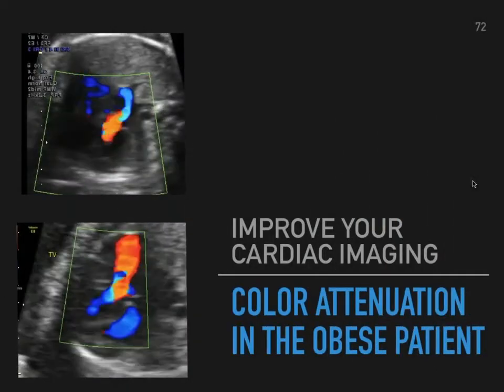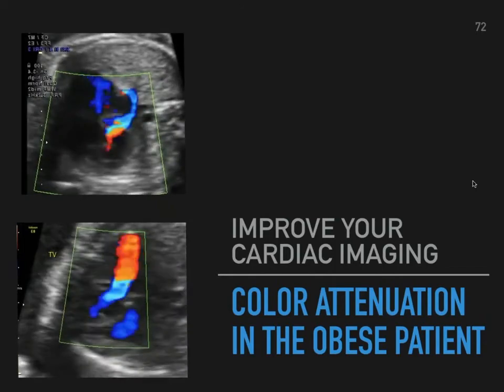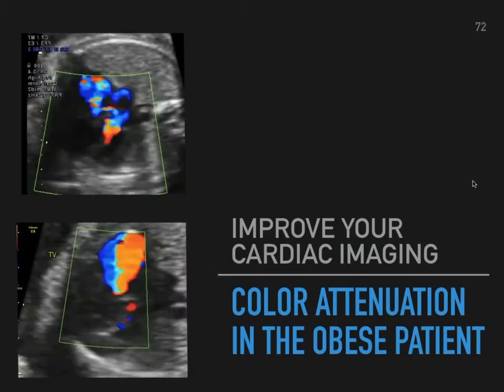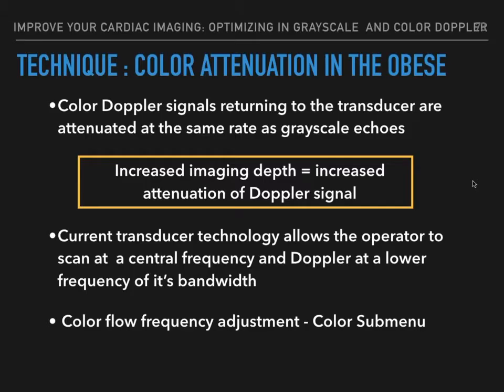So another excellent technique with color Doppler, with tips on attenuation in the obese patient. So color Doppler, as we all know, the signals returning to the transducer are attenuated at the same rate as grayscale echoes. So increased imaging depth is actually equal to the increased attenuation of Doppler signal.